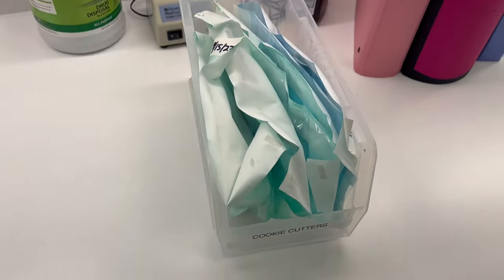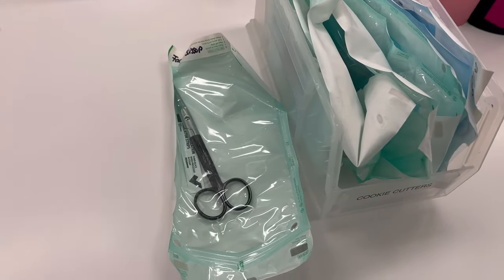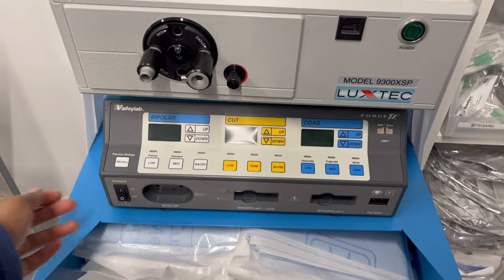And then I go back over to the OR section, and I just pull little things that I think the doctor is going to need. This doctor that I work with, he likes using the facelift scissors. No matter what we're doing, he likes the facelift scissors. He did not use them this time, but I usually just pull them and have them there.